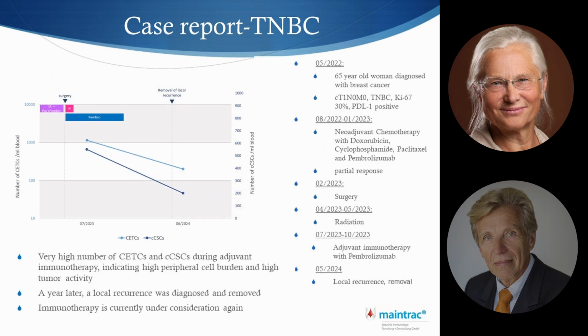Stemtrac, which was only performed recently, showed elevated circulating stem cell level, and therefore the patient should remain under close monitoring. And this patient was an elderly woman who had a triple negative cancer, but was PD-L1 positive. So she received neoadjuvant chemotherapy with doxorubicin and again with the checkpoint inhibitor pembrolizumab. She had only partial response, which we would like to see complete response in triple negative patients, and had surgery and subsequently radiation. We only analyzed her during the subsequent adjuvant immunotherapy, again with pembrolizumab, and she had very high numbers.